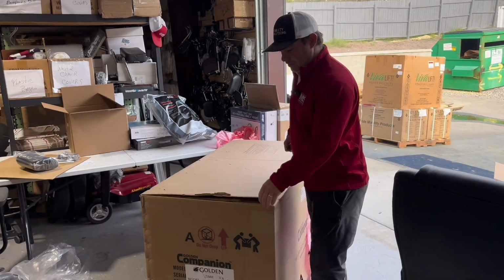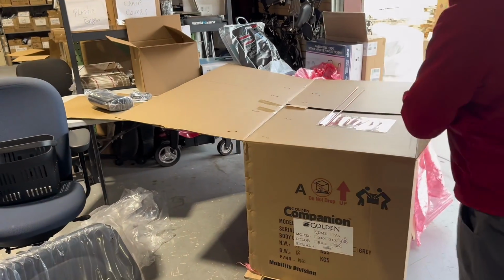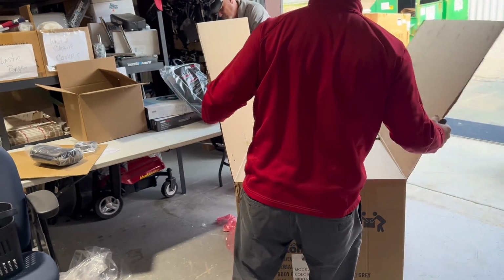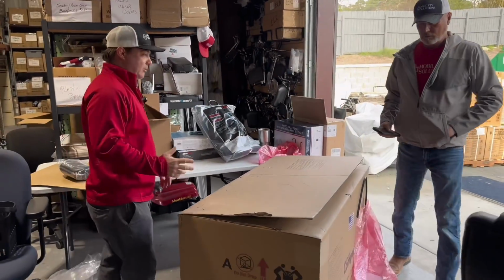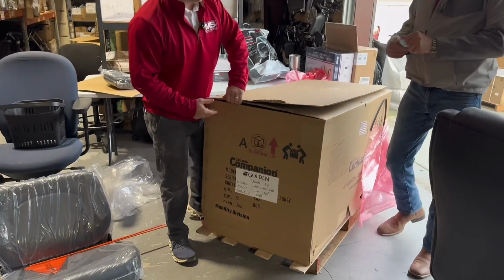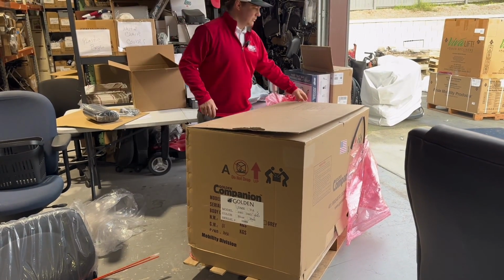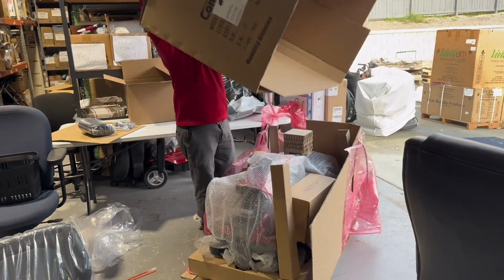All right, so just cut those straps. If you don't, I'm going to show you this real quick. They put the flags up here, so get those out. But good morning, buenos dias, so that means good morning. This right here could just come up, but if you do that, you won't be able to see the flags if you just pull it straight up.